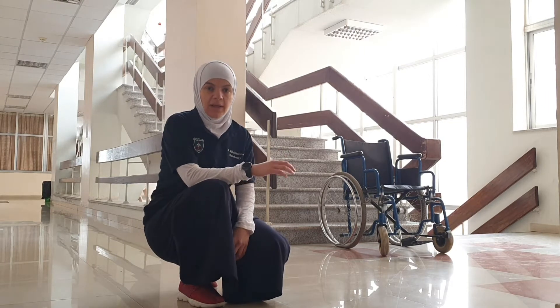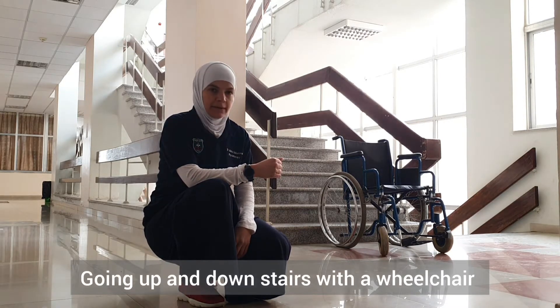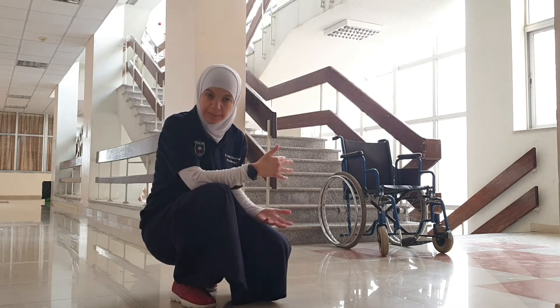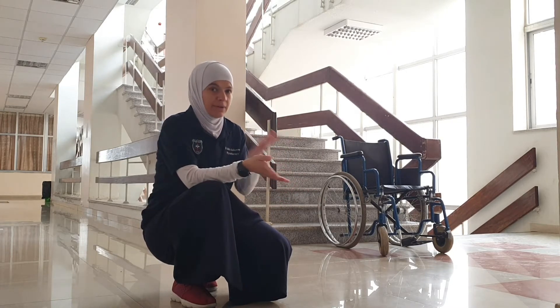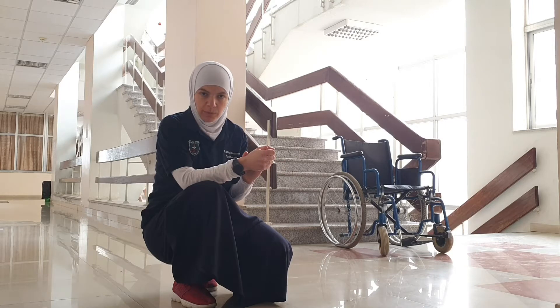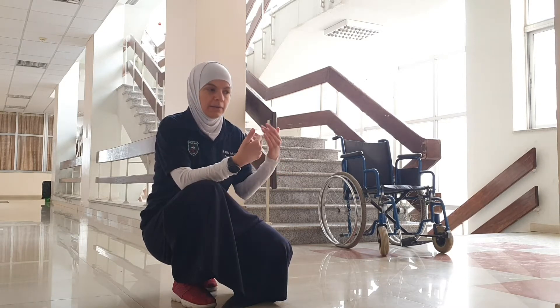Among the very important skills that patients need to be familiar with when using their wheelchair for mobility is how to manage steps. This is very important because patients might often run into steps they need to go up or down — for example, if they are visiting family or need to go somewhere where there are steps and no other way. We will teach patients what to do and how to organize the help they will be getting, so the person in the wheelchair can ask anybody in the environment to help them.